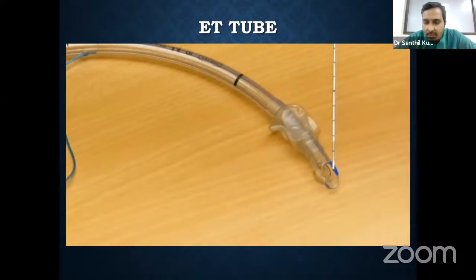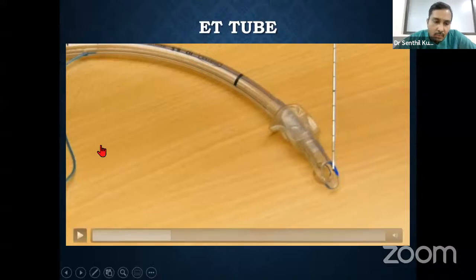So it is very important, even though we have a lot of measures to check the tube is inside the trachea, the most important thing is you are supposed to see the vocal cord and you are supposed to see the tube entering into the vocal cord. So the curvature and the bevel are going to aid us in visualizing the passage of the tube. That's why there is a bevel. So we have to utilize all these things.